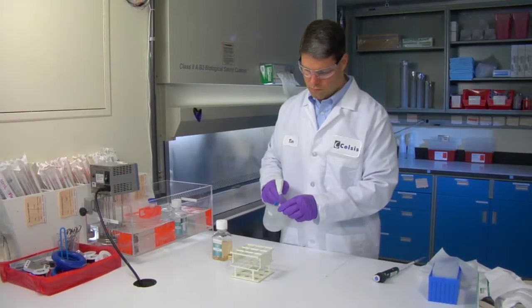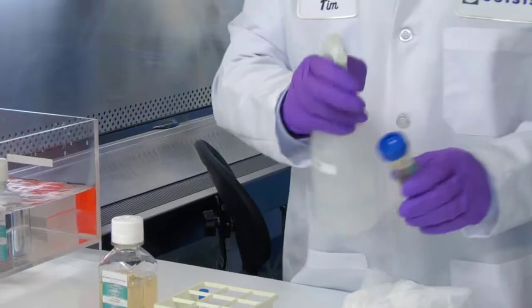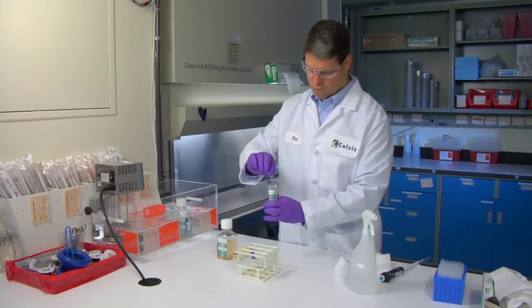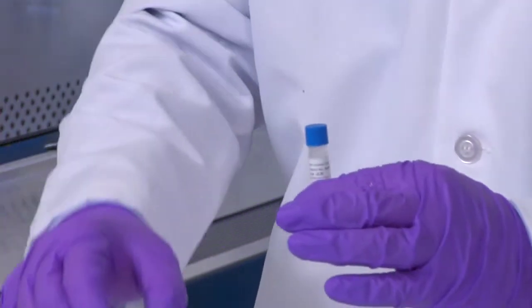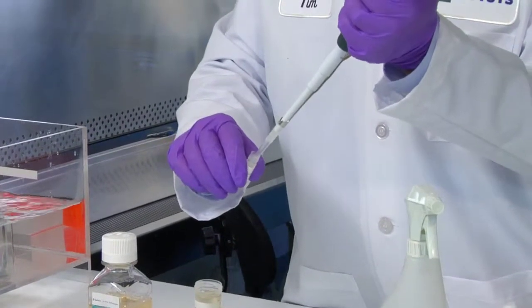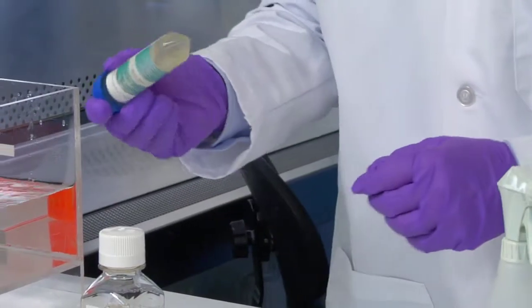Quickly spray the vial cap and 50 milliliter conical tube with 70% isopropyl alcohol and wipe with a chem wipe. Decant the vial into the 50 milliliter conical tube of pre-warmed in vitro grow HT medium. Transfer one milliliter of hepatocyte suspension from the conical tube to wash the cryovial for excess cells and pour into the conical tube. Gently invert the tube three times to mix the cells evenly.